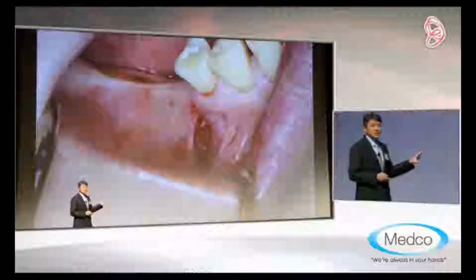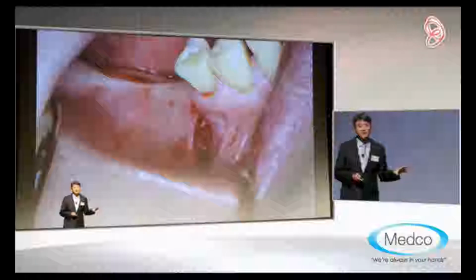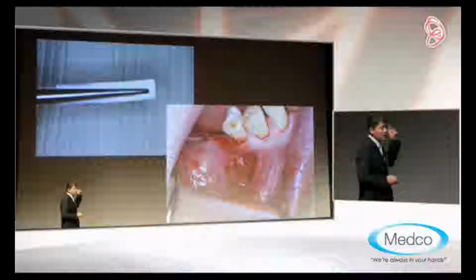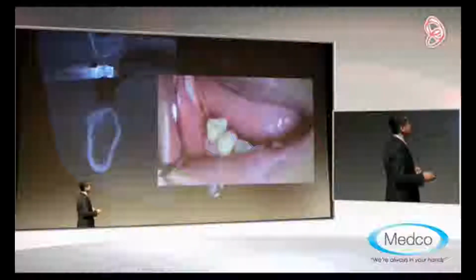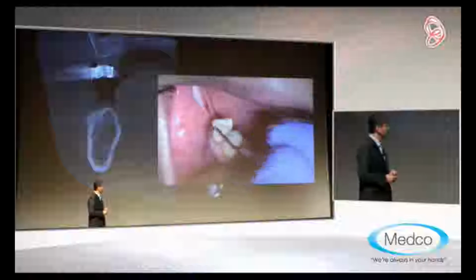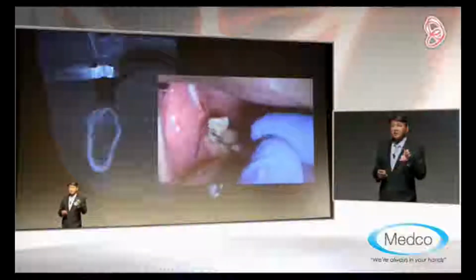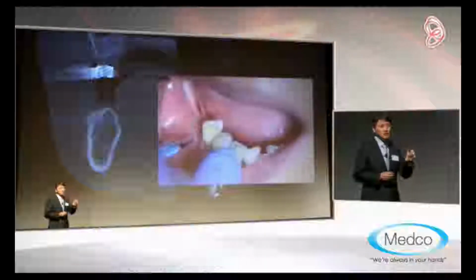Same procedure, you just have to respect the mental foramen, and we make a very long tunnel, and we will use collagen membrane. Let's look at the video. So before the surgery, you look at the panoramic X-ray and you measure where the mental foramen is.